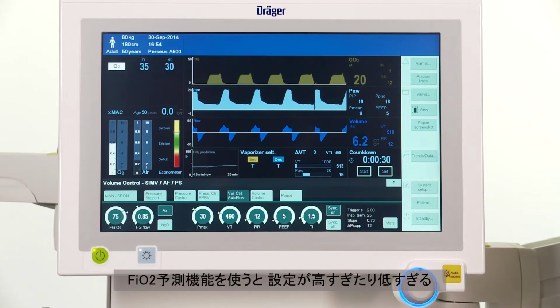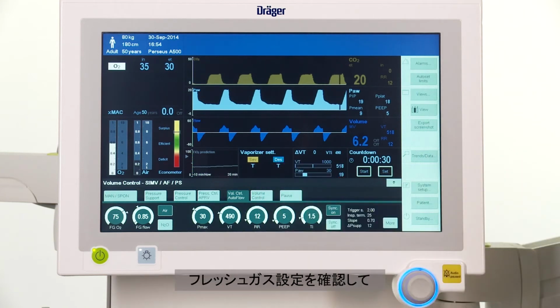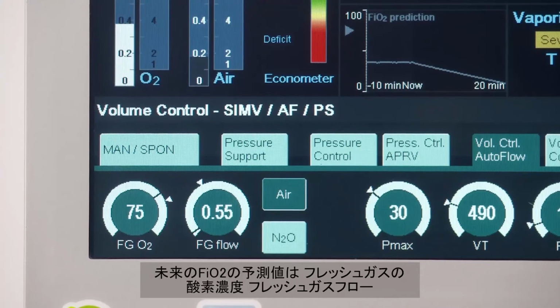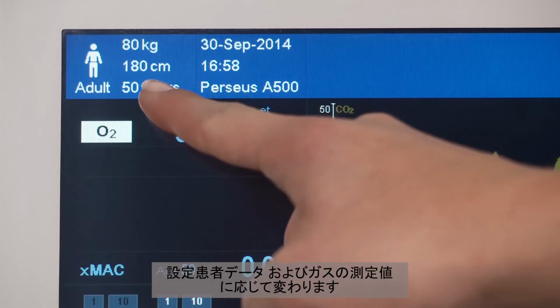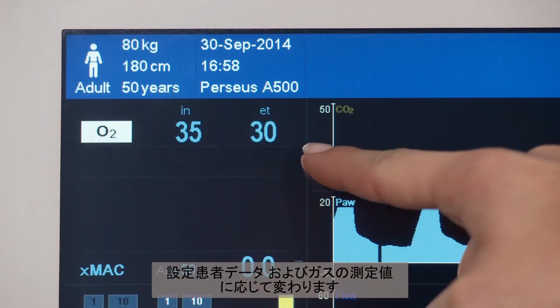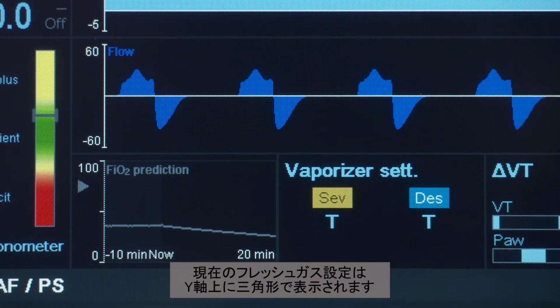The FiO2 prediction function helps you to detect fresh gas configurations that were set too high or too low and ensures the consistent FiO2 level required during the entire surgical intervention. The prediction of the future FiO2 depends on the oxygen content of the fresh gas, the fresh gas flow, the set patient data, and the measured values of the gases. The current fresh gas setting is indicated as a triangle on the y-axis.